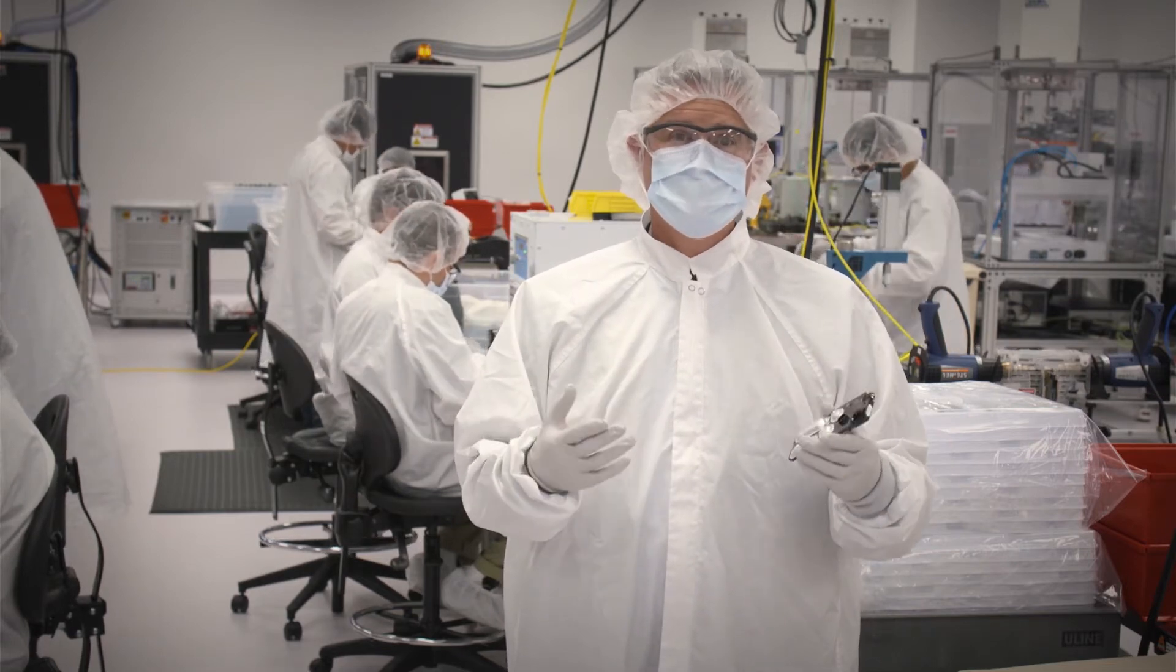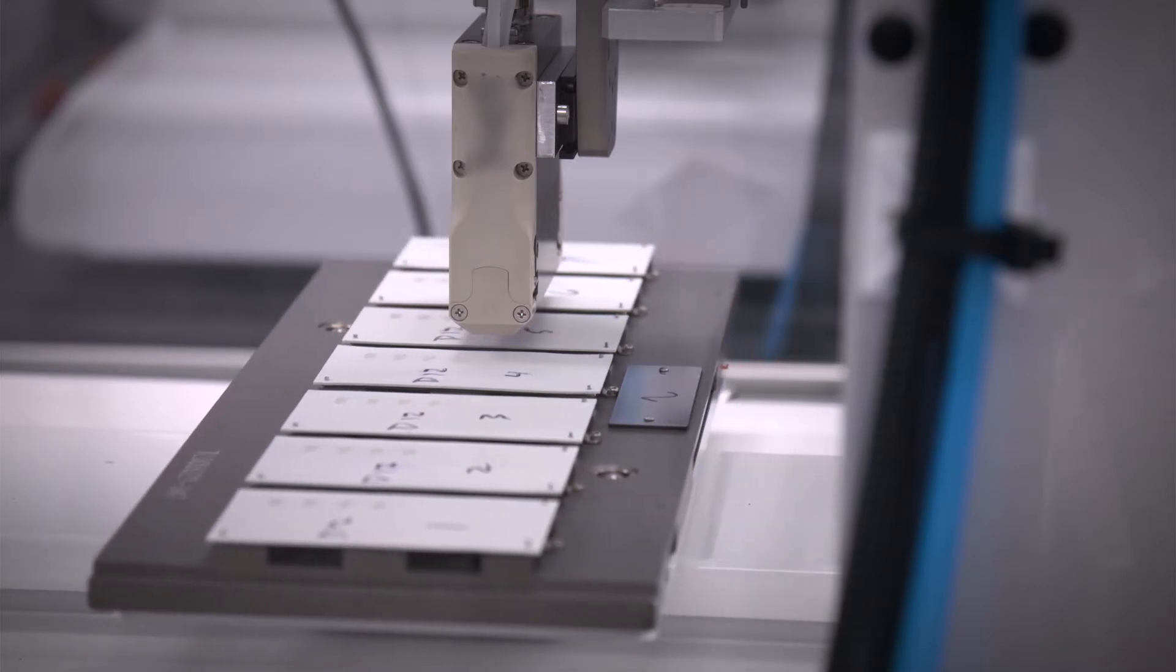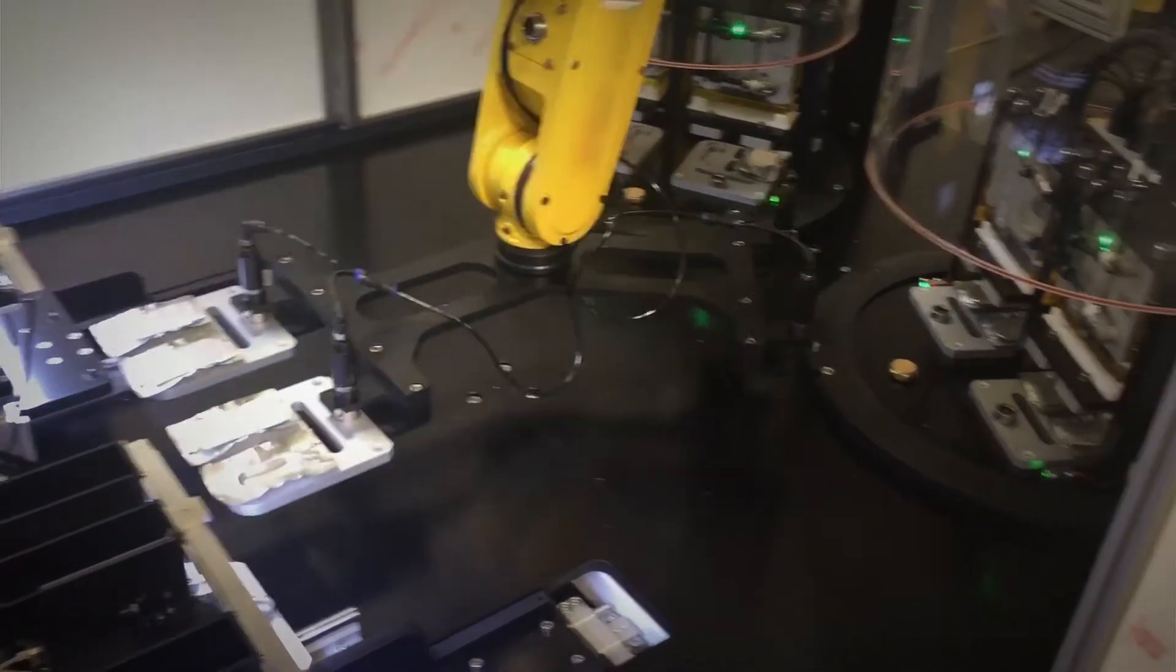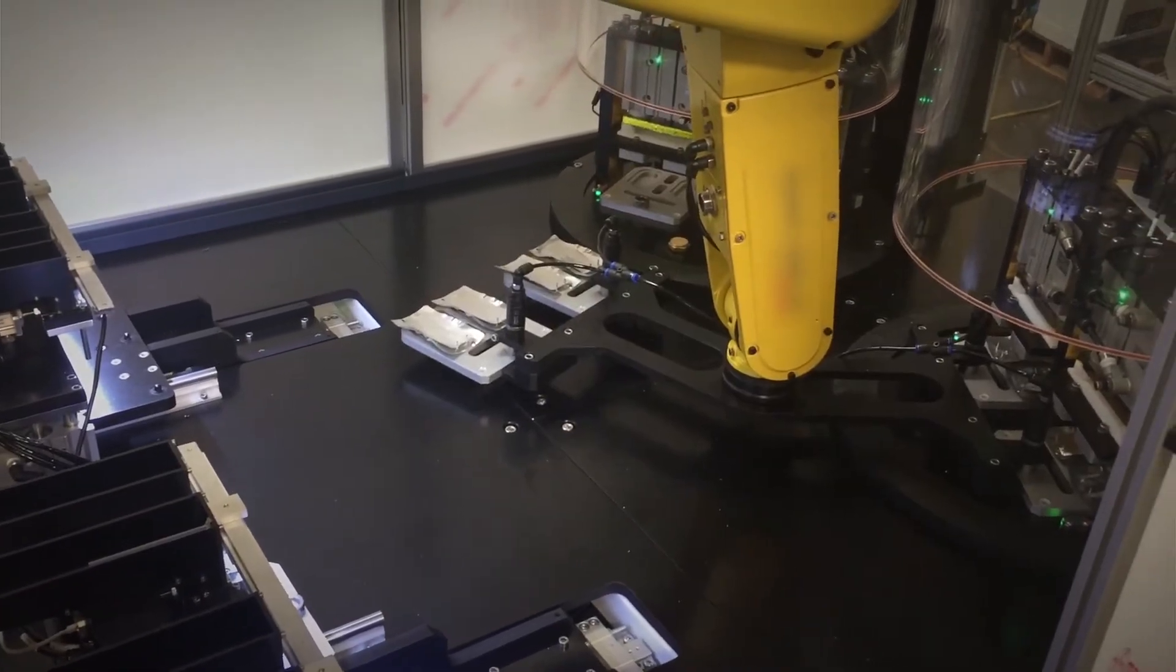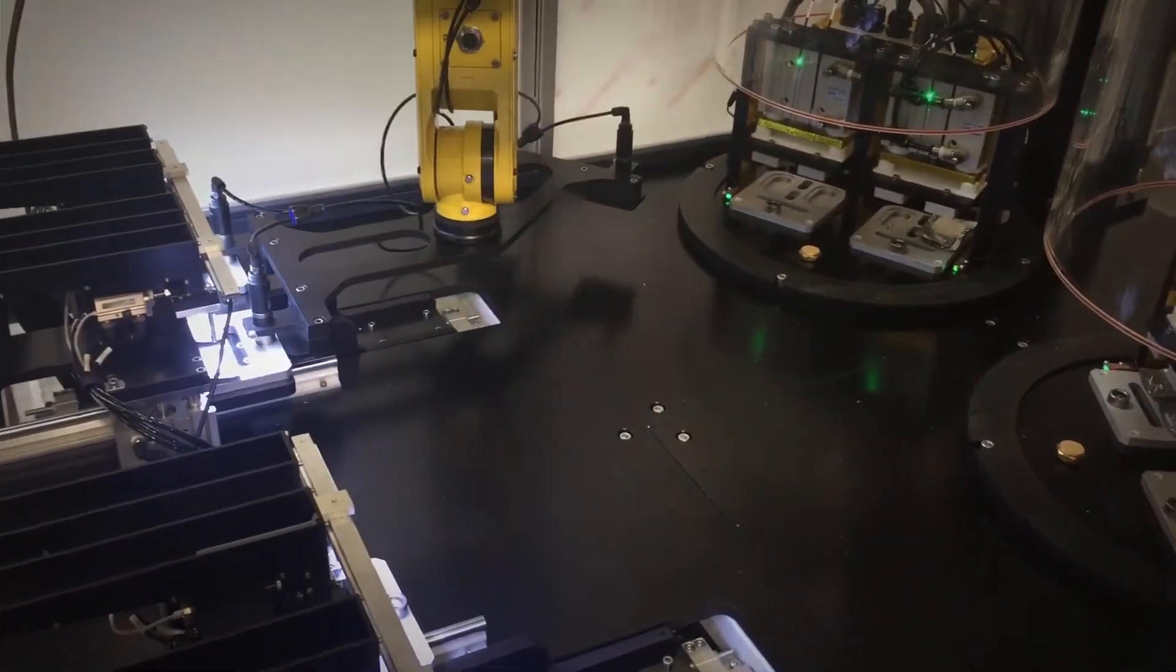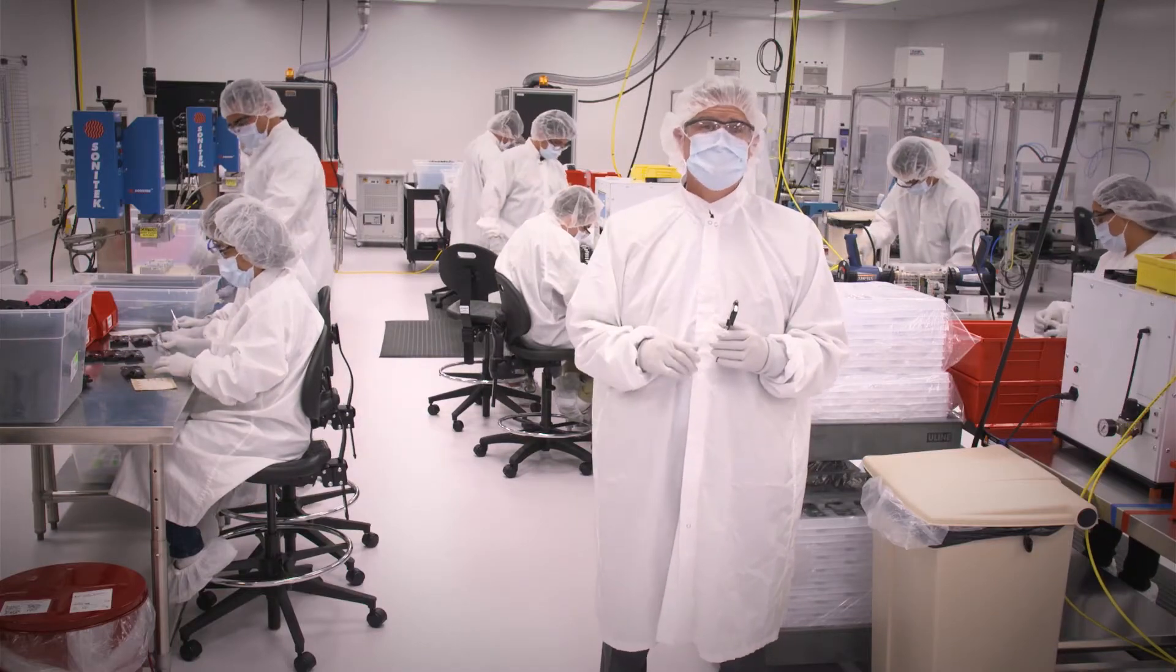As we continue to scale our operations, LRM assembly is a process where we are adding more automation. For example, this is a custom industrial robot we developed to handle one of the liquid reagent components of the ePlex cartridge. Now that we've reviewed LRM assembly, let's head over to the coating room.